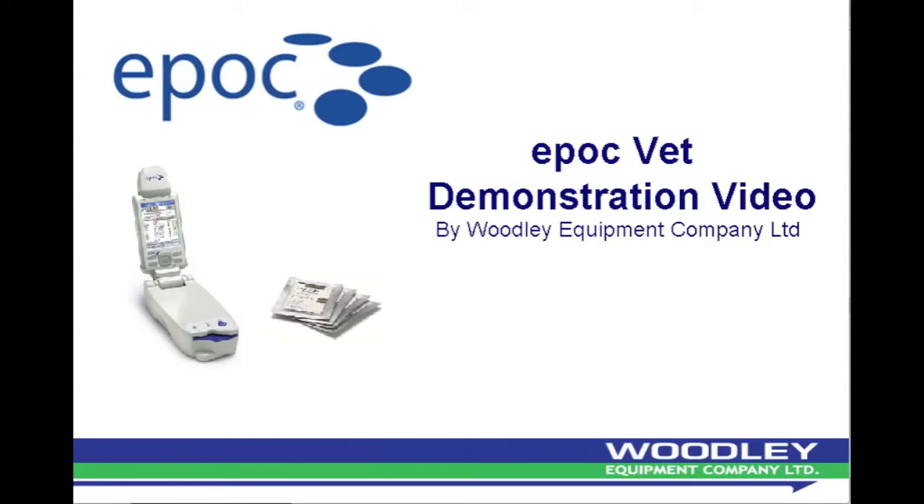Hello, this is an EPOC training video brought to you by Woodley Equipment Company Limited. We will demonstrate how to run an EPOC test and talk you through the important things to consider.